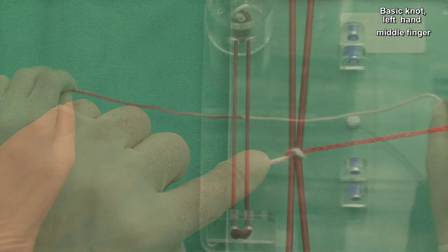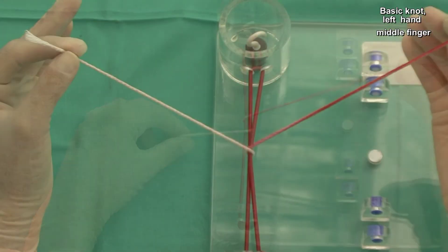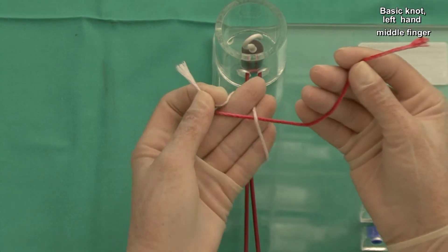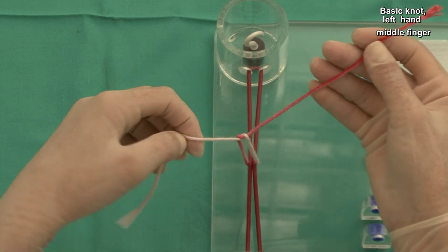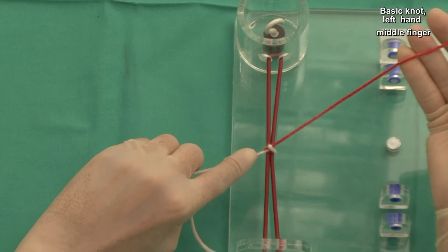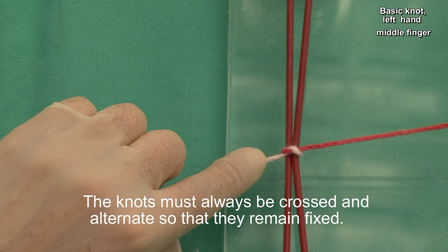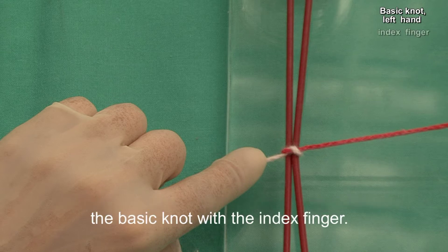Let's see it again. The knot must always be crossed and alternated so that they remain fixed. For this purpose, we will make the second type of knot, the basic knot with the index finger.